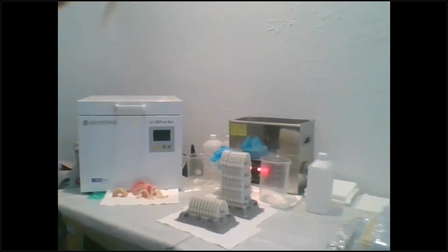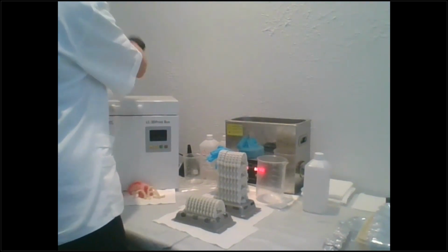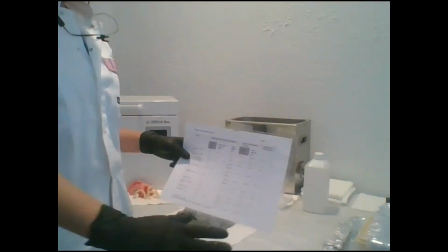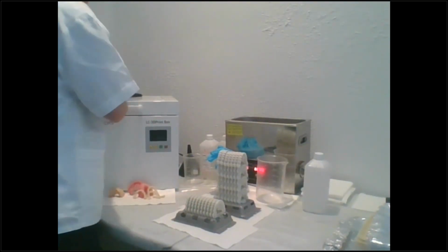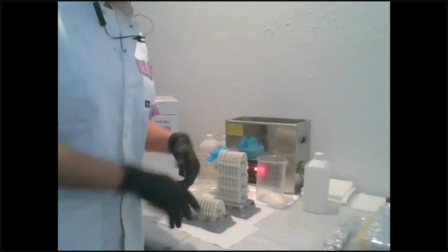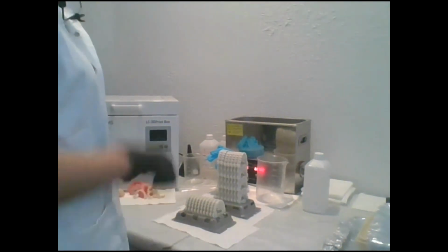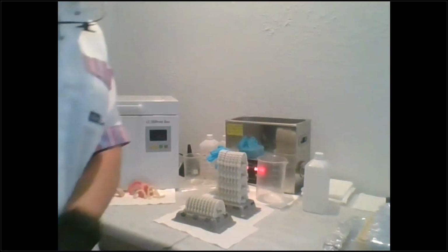Okay, so here's what I have. I have my stirring, curing, and mixing chart here, and it's laminated. This way I can always see how long things need to mix, stir, and cure, okay? And I can just wipe that off. You can just get that right on the user guide. You just go to a print view and print it out and laminate it if you want, or just keep reprinting it every time it gets dirty.